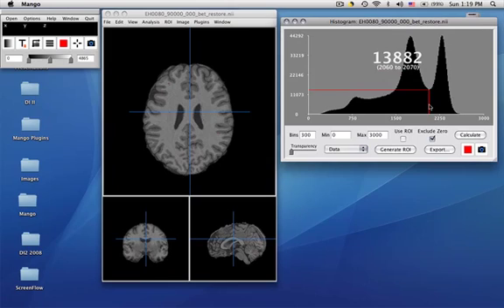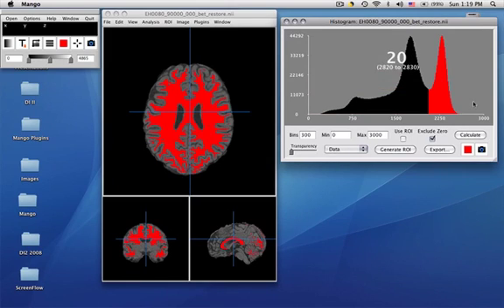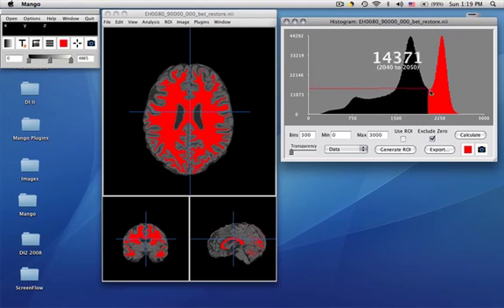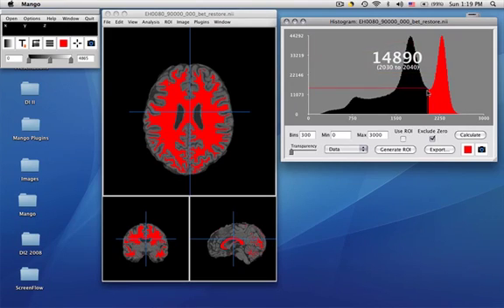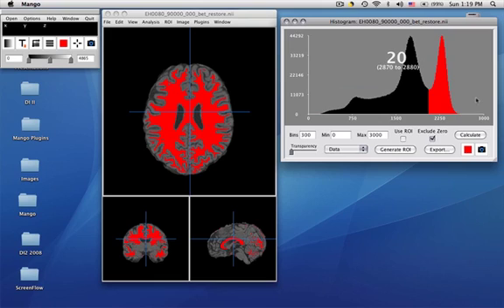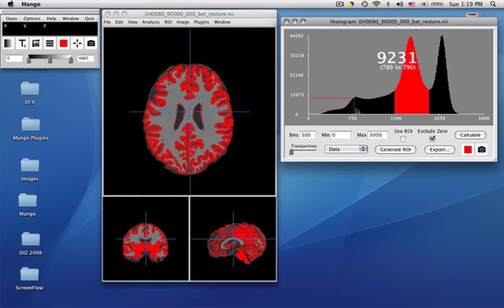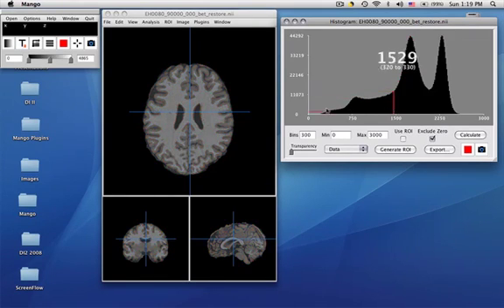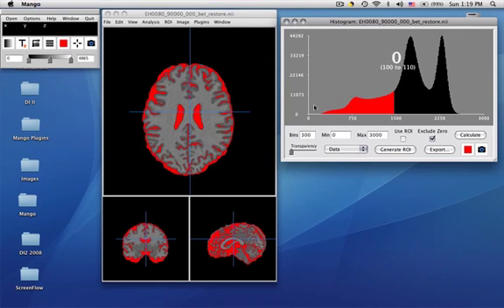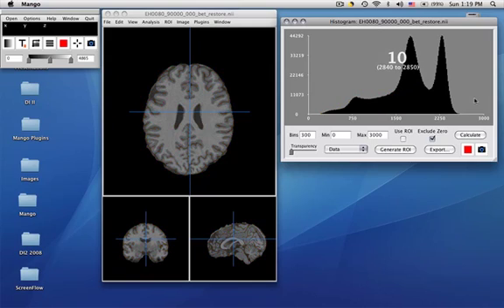Beyond just setting an anchor, you can set an anchor and do a shift-click and highlight a range. In this case, we're highlighting from the bottom of the distribution between these two big distributions up to above this one. We can move to this side, shift-click. Before we had white matter, now we have gray matter. If we set a new anchor around here someplace and click down here, we see mostly we have CSF. This is a very nice way to highlight ranges to see what in the image correspond to what image ranges.